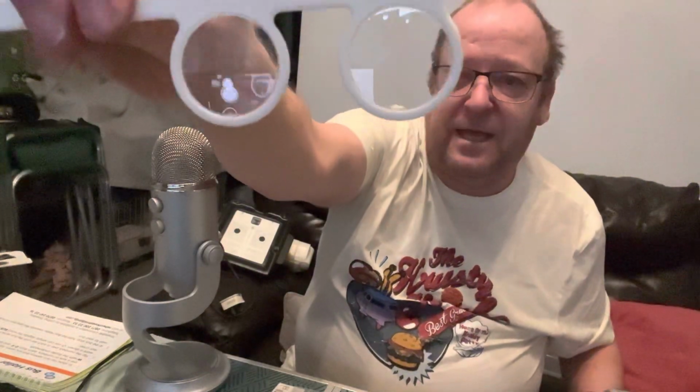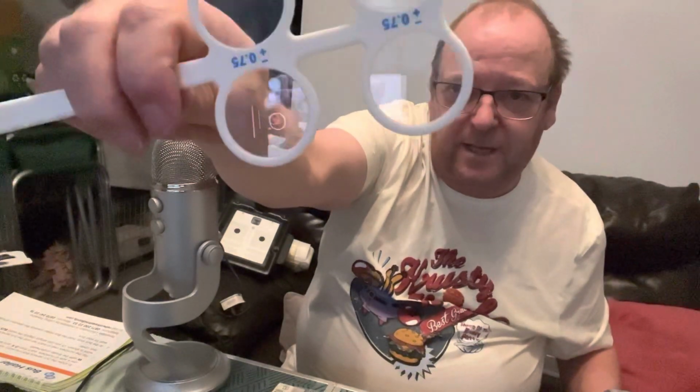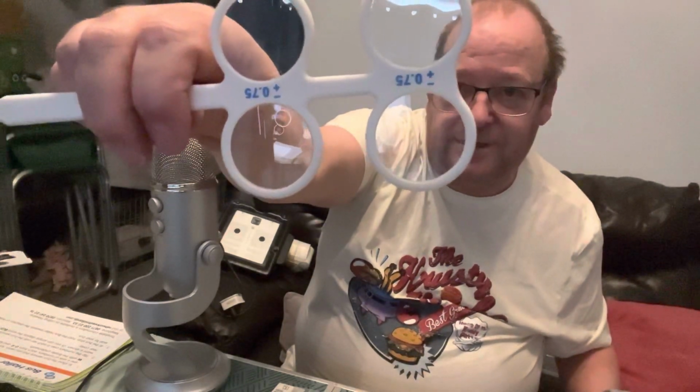So you've got the 0.50. Next paddle is 0.75, so again you'll see that it slightly magnifies. Twist the paddle, now that minifies it, and you can see the writing across the middle of the paddles that shows you what power it is.